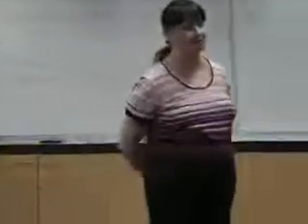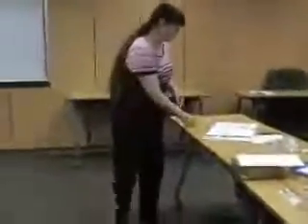Yes, ma'am. Can you go over putting the air in the insulin? Sure. Yeah. I'll just mimic it. In fact, she has real small insulin bottles, so I'm going to pull them out like this. Okay? So Terry can see. I won't do it through. I'll just mimic it for you. Okay? So I know my order, right? And I tend to do things right-handed, so I'm going to put my regular on my right-hand side. That's just me. If you get a system, sometimes it keeps you consistent.